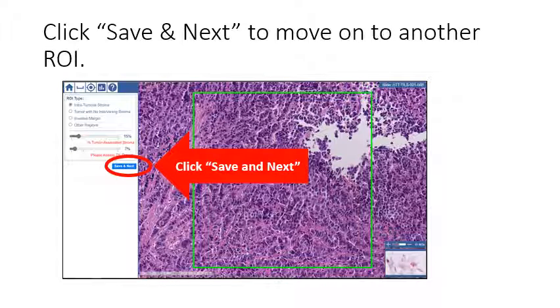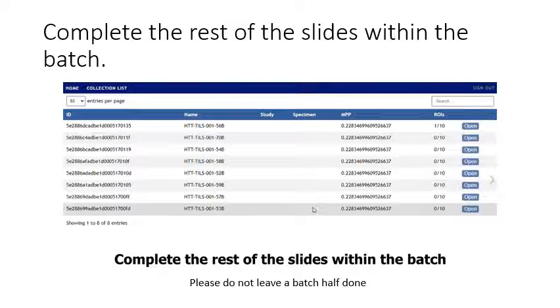Once you are finished, please click save and next to move on to another ROI. Once you have completed the entire slide, select the home button. After you evaluate all the ROIs for an image, you will be taken to the batch work list. Please continue with the rest of the slides within the batch. We may not be able to include partial batch results.